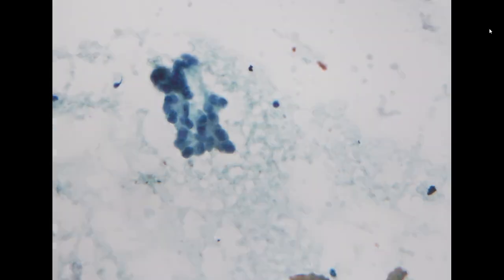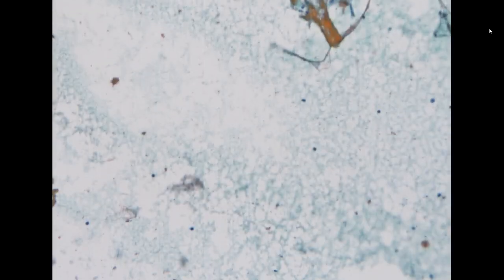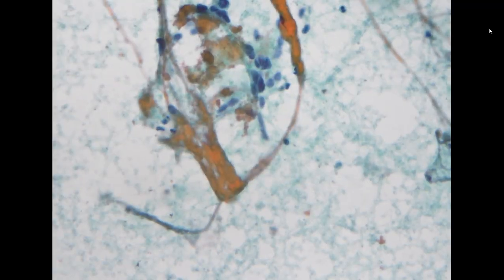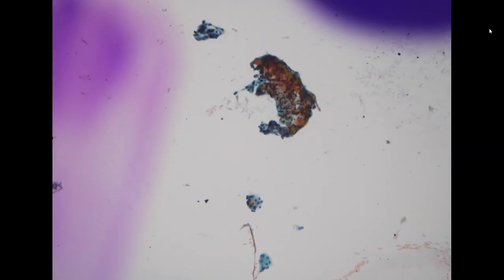And we see some clusters of follicular cells. These follicular cells show overlapping nuclei, and the nuclei are slightly enlarged. It also shows a microfollicular pattern. So because there is scant colloid, basically no colloid, and there are microfollicles, and the nuclear features are also a little bit enlarged. And we see in one or two clusters areas suspicious for pseudo-inclusion.